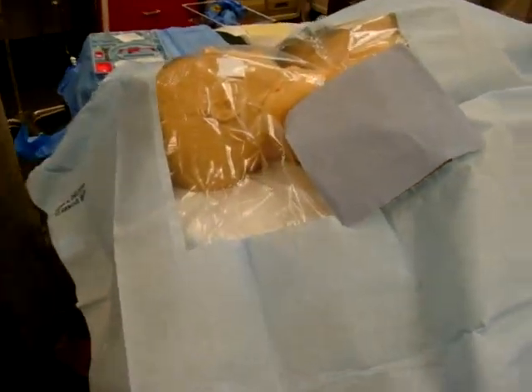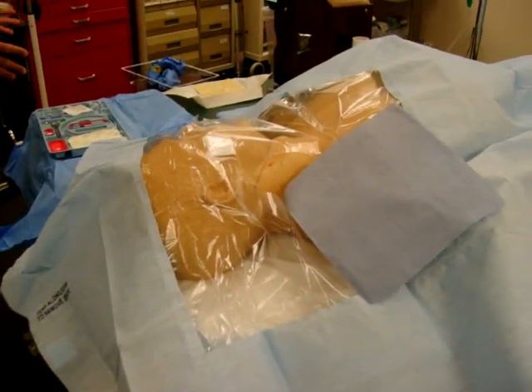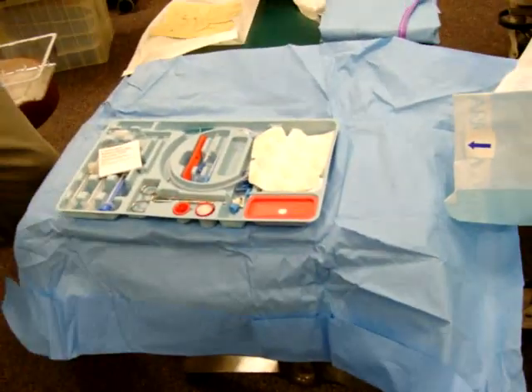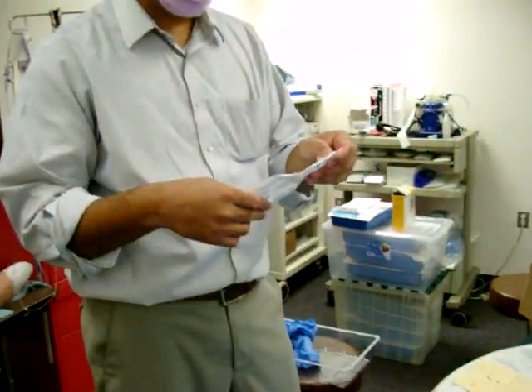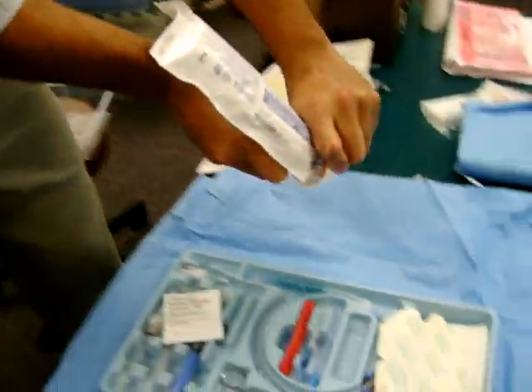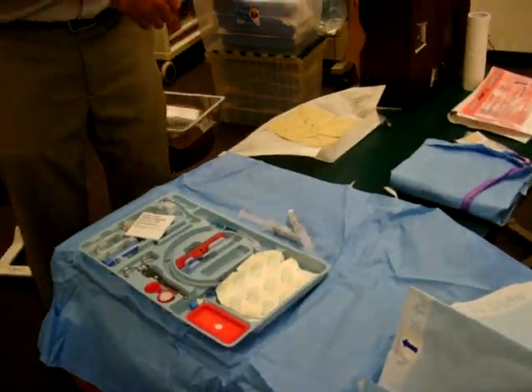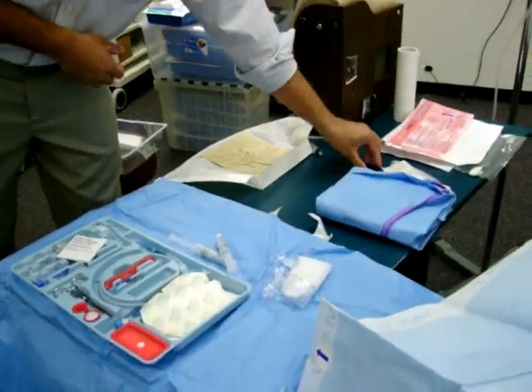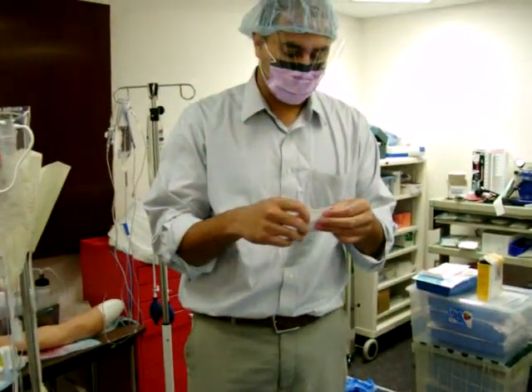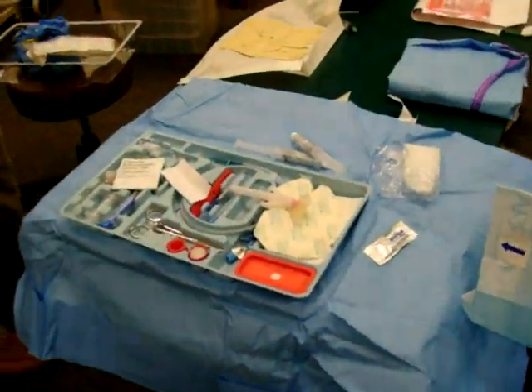Sometimes it's nice to have a second hand here just comforting the patient if they're awake and not sedated. My kit is sort of ready and my gown is out. Now I have to make sure I put everything I need on this field for my procedure if I'm not going to have a second hand to hand me stuff. You're going to be flushing your central line, so it's a good idea to go ahead and place your flushes there. The sterile probe cover would be dropped on that field with some sterile jelly for the probe. At this point I'll also put my chloroprep and clean the patient one last time before I start the procedure.